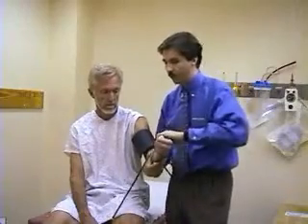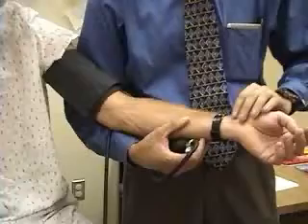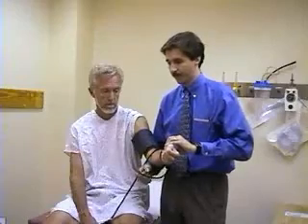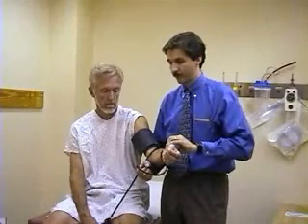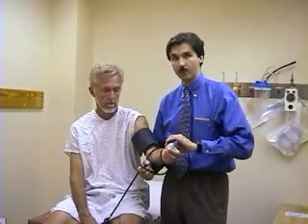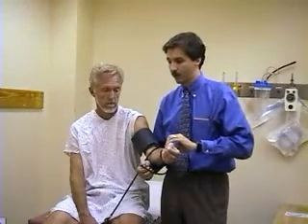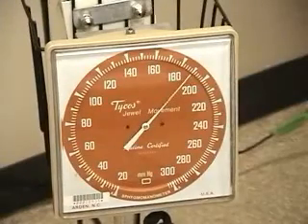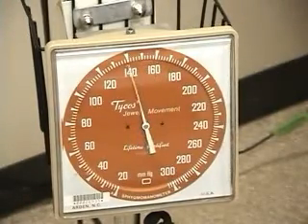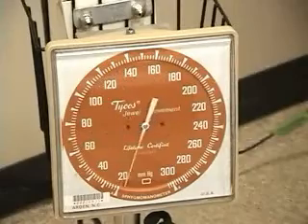First, we're going to palpate the systolic pressure at the radial artery. We're going to pump up the cuff until we can no longer palpate the pulse at the radial artery, then go another 20 millimeters of mercury above that. Then we're going to let it down slowly until we can feel the pulse again, then rapidly deflate it. That estimates the systolic blood pressure. You determine the systolic blood pressure by palpating first, to avoid the auscultatory gap.